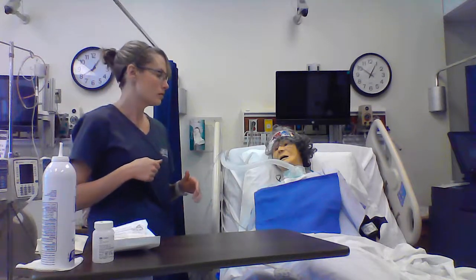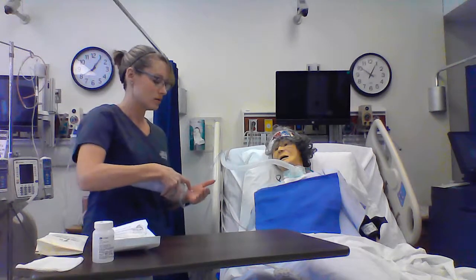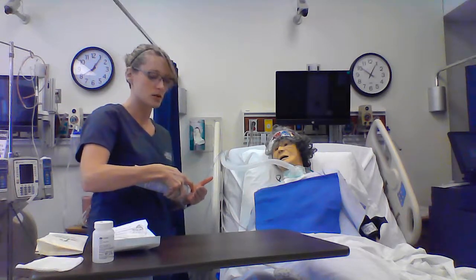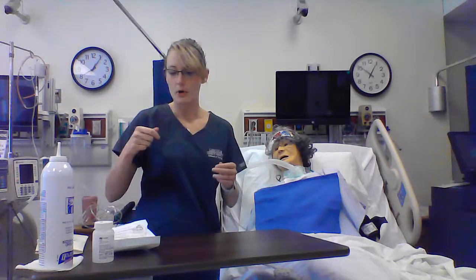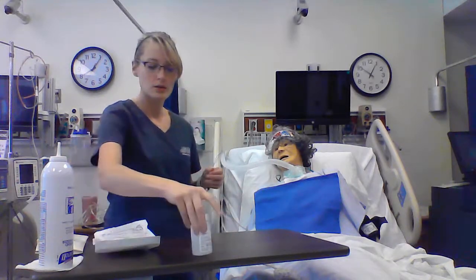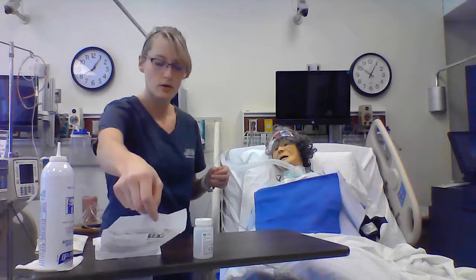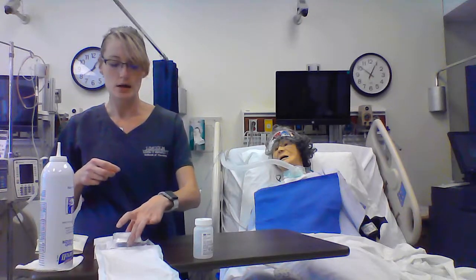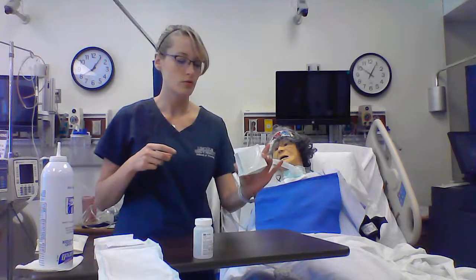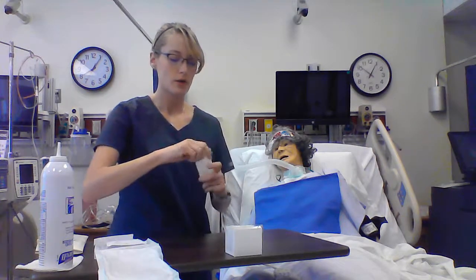So now that she is in high Fowler's and good and oxygenated, I'm going to clean my hands one more time, and I'm going to go ahead and start getting my supplies out. So I'll open my suction catheter kit away from me and take my box out for my sterile normal saline and go ahead and pour that in.